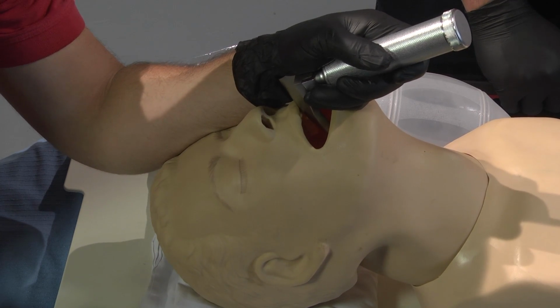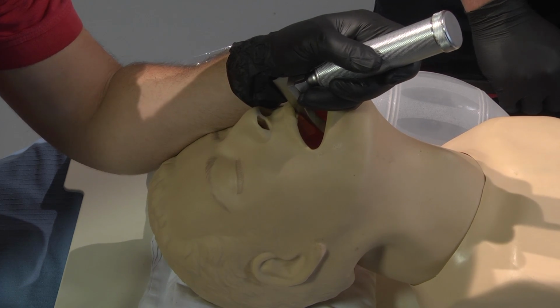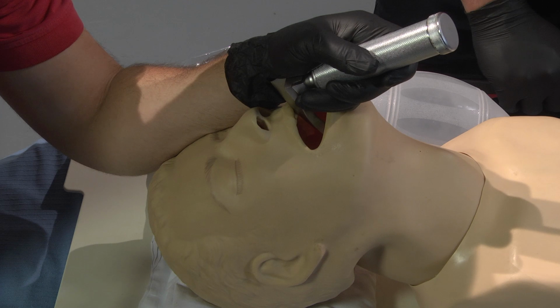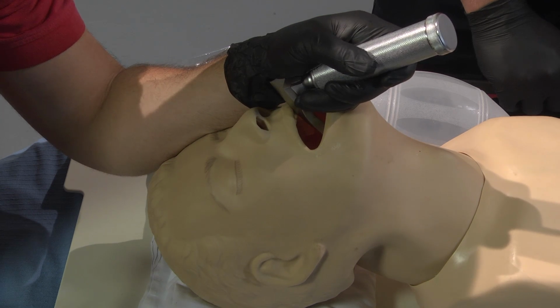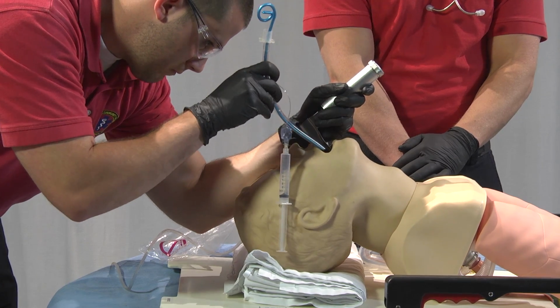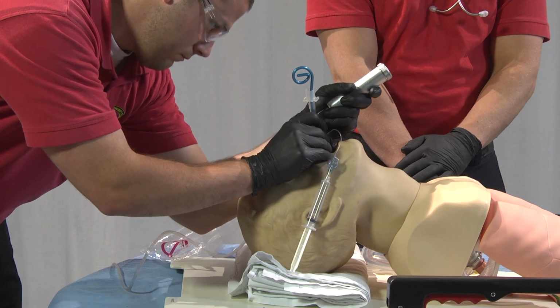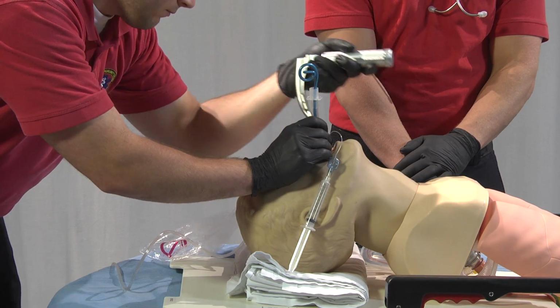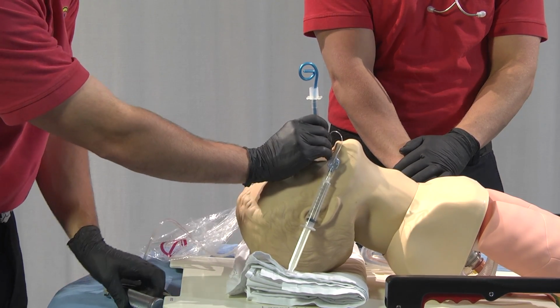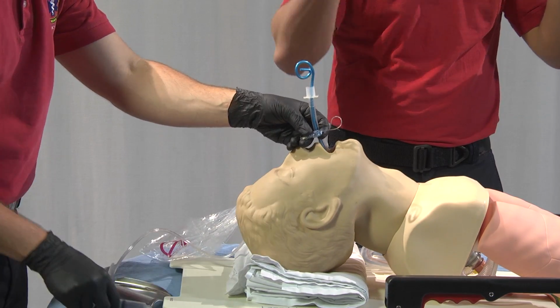Upon visualization of the glottic opening, take a mental note of the view to classify for documentation. Accepted standards include the Cormack-Lehane scale and the percentage of glottic opening scale. For specific recommendations, seek advice from your medical director. Insert ET tube and advance to proper depth. Cuff is just slightly distal to the glottic opening. Inflate the cuff and immediately remove the syringe.